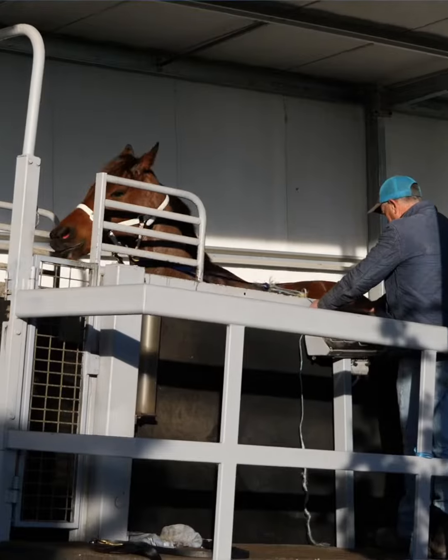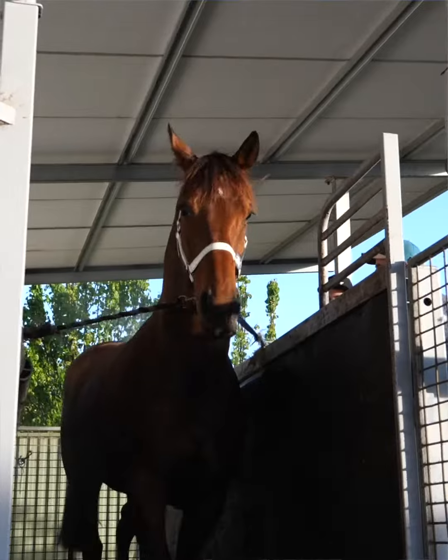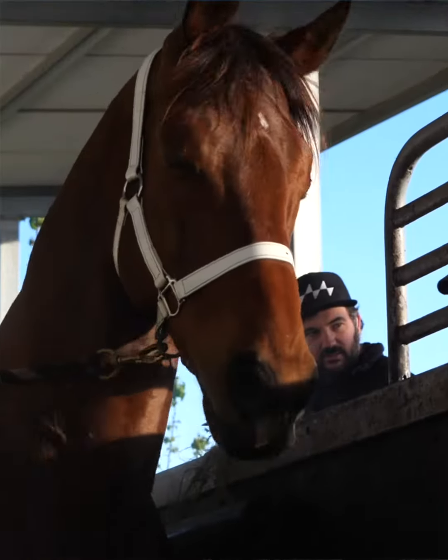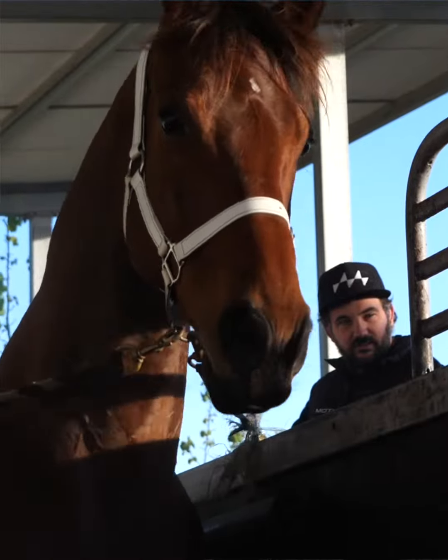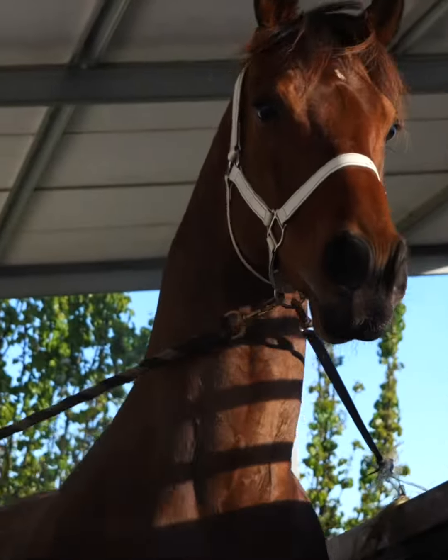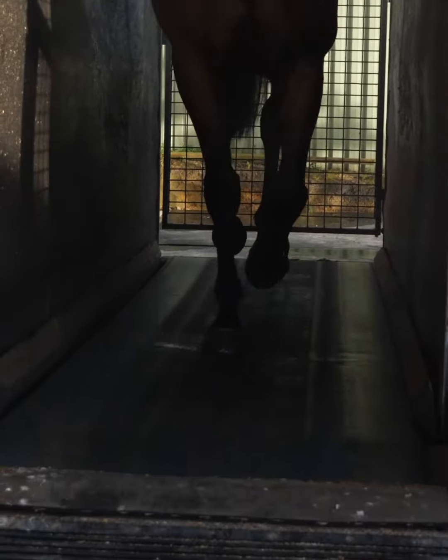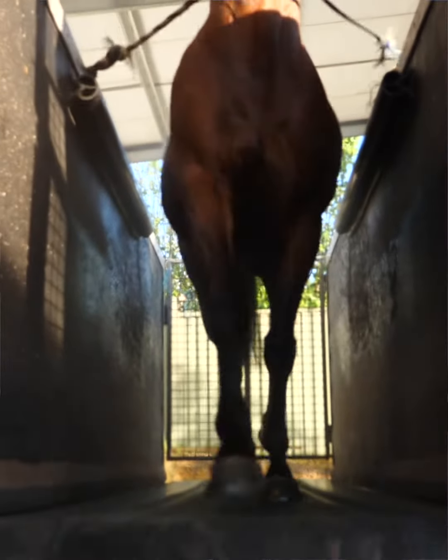What that means is you're stretching that tendon while it's under load and lengthening it. We've had some great success rehabbing tendons now, to the point where it's not even a major concern like it used to be, and you get them all back to racing reasonably quickly. Possibly even those horses could be maintained and trained on the treadmill and do all their fast work on it. Tendons and suspensories hate deep sand, so giving them that really even, firm surface in a straight line gets them really fit for racing without unnecessary damage.